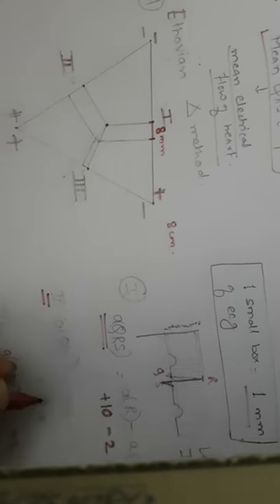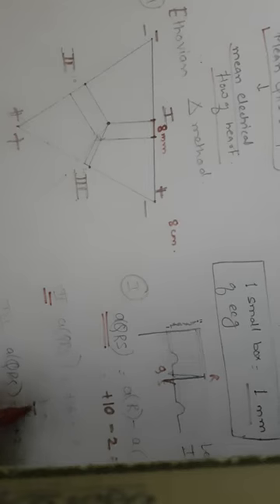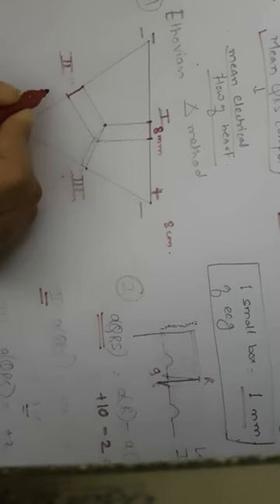In lead 2 the amplitude of QRS complex is 10. So towards the positive side of lead 2, we have to mark up to 10 mm. Okay.